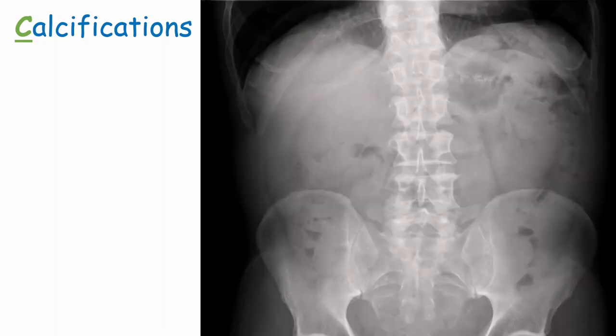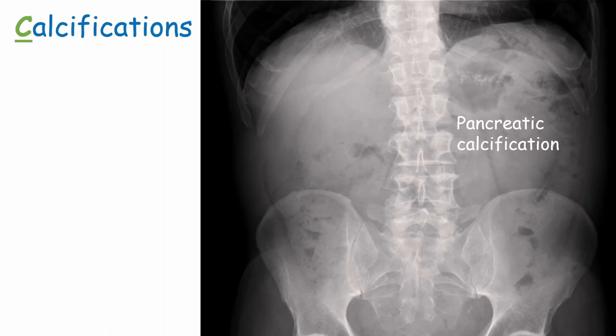Pancreatic calcification on an abdominal x-ray is usually a result of chronic pancreatitis and is a late sign of the disease.